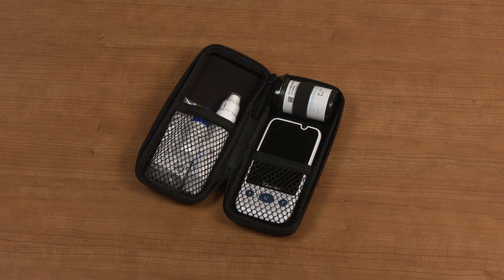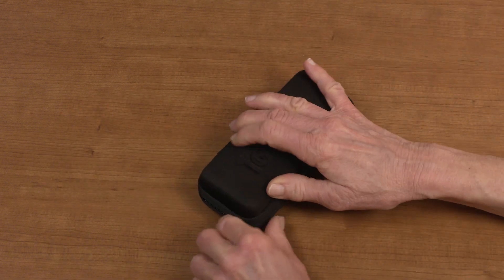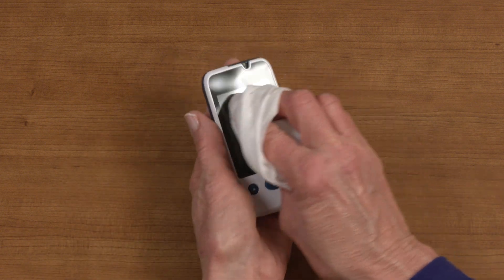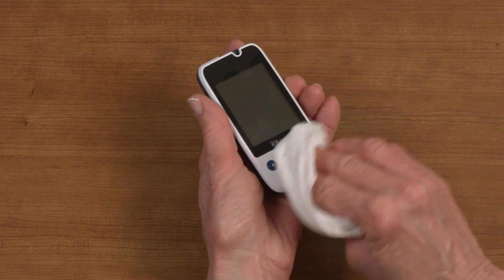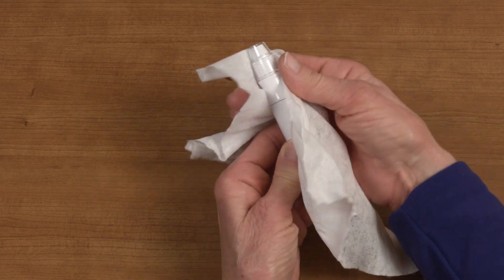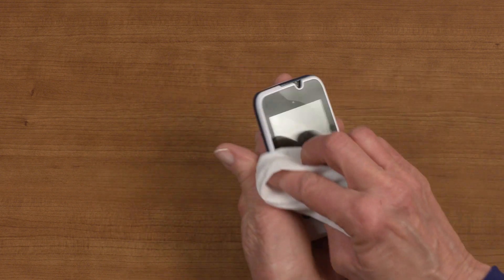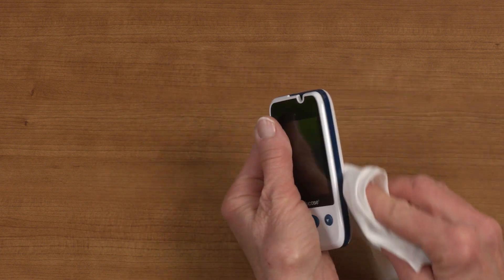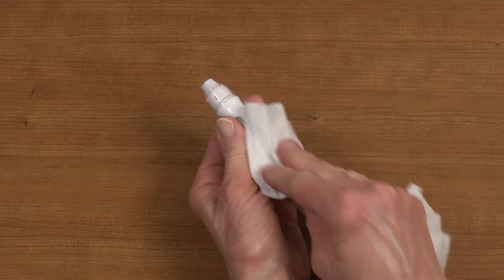For best use, keep your iGlucose meter and accessories like test strips dry and dust free. We recommend storing them in the carrying case at room temperature when not in use. To clean and disinfect your iGlucose meter and lancing device, thoroughly wipe down their entire surfaces with a damp cloth or disinfecting wipe. Be careful not to get the strip port wet on your iGlucose meter. Then take another disinfecting wipe and wipe down the entire meter and lancing device again. Allow them to remain wet for 2 minutes before letting them air dry.